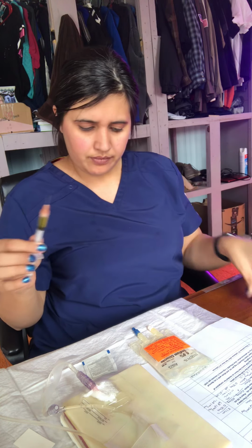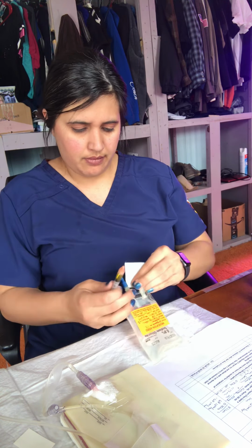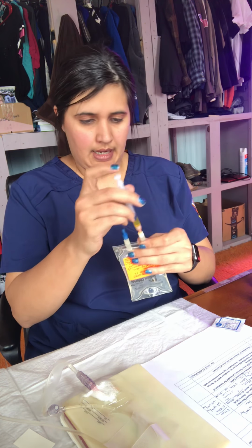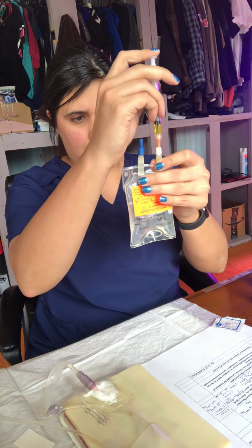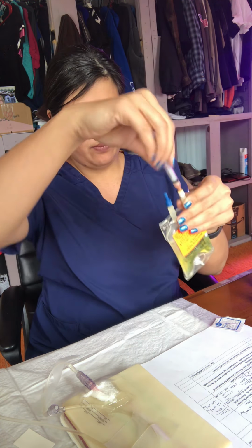Pull that out. I will clean this little port here. Clean the port and insert, and add to this medication. I will dispose in my sharps container. Oh, it doesn't want to be in there. That's not good. I'll just leave it like that. Okay, dispose in my sharps container.